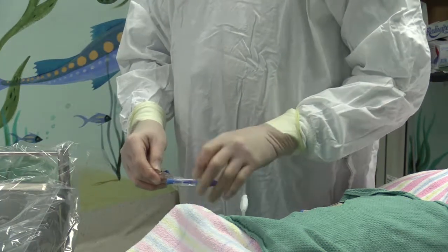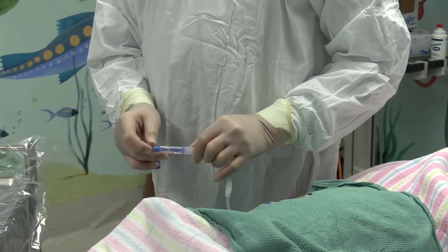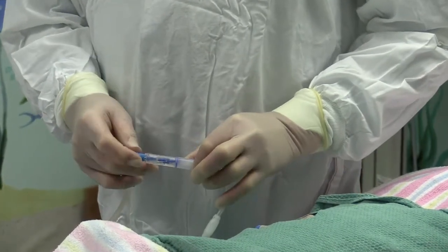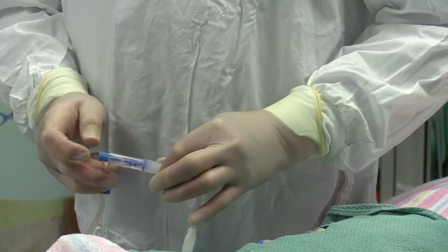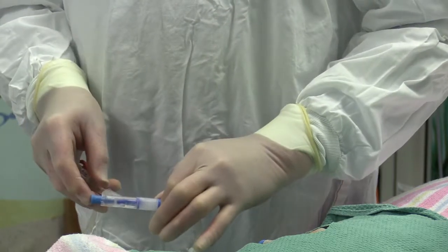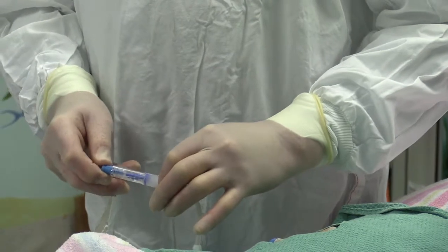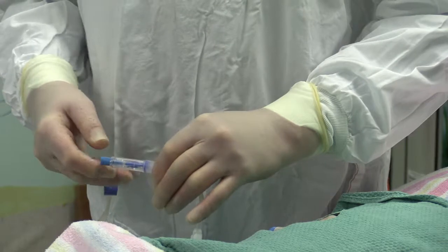Now, once that's secured, please note that there is a pin in the side of the lumen of the administration set. That pin must not be depressed. That's only at disconnection. If the pin is depressed, then it will block the fluid pathway and we won't be able to administer dialysis fluid into the patient. So it's very important that that pin is not depressed until the treatment is completed.